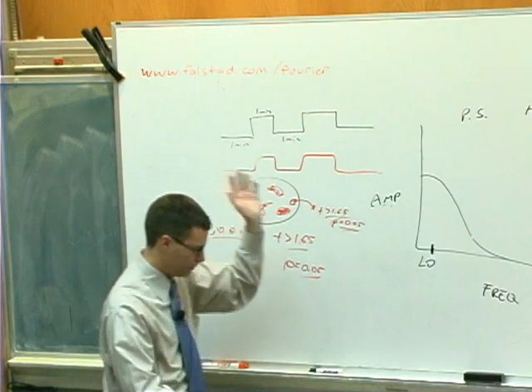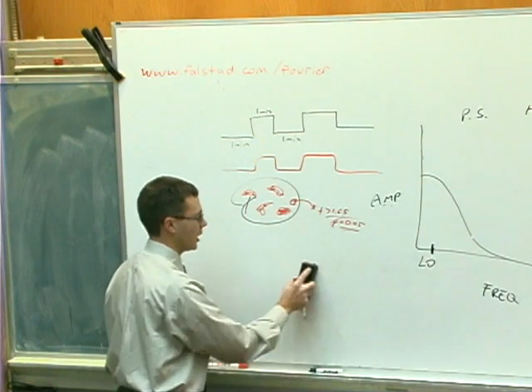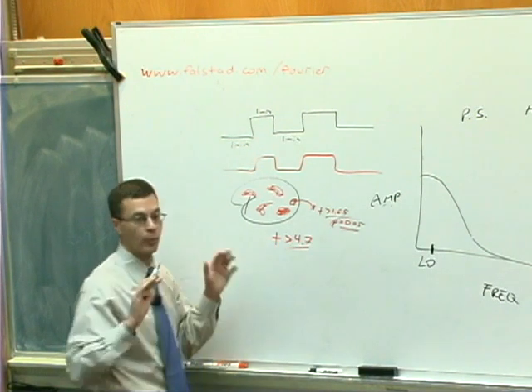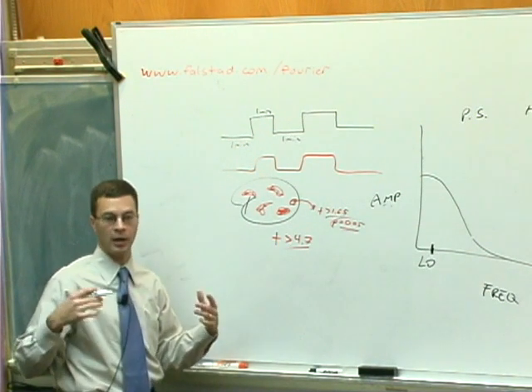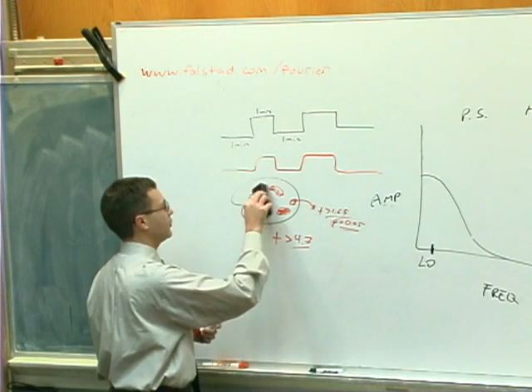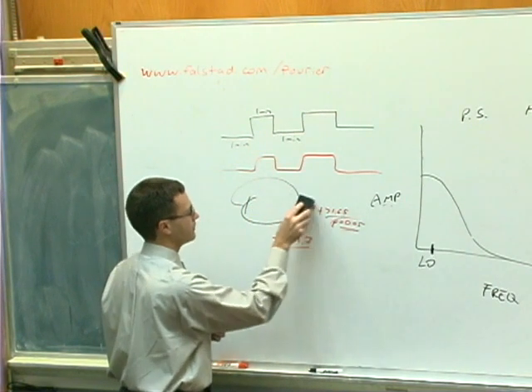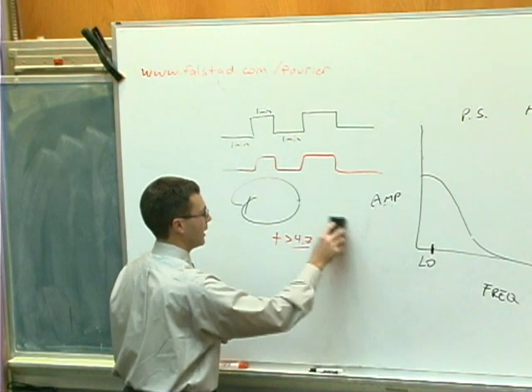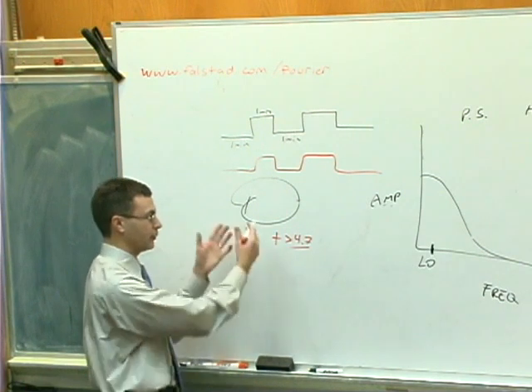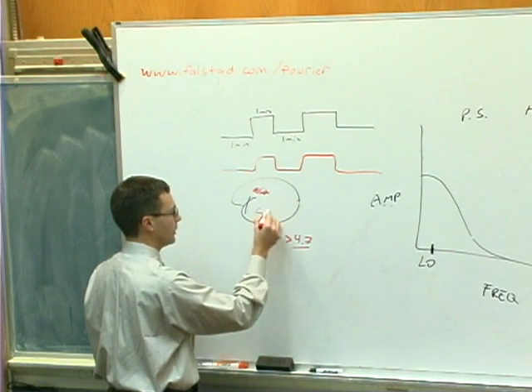So, whatever, I'm a sophisticated analyzer of BOLD fMRI data. I do some sort of correction, which we're going to talk about a little bit more on day 3. And so I now say the t has to be greater than 4.7. Take my word for it, this corrects for the number of voxels that I'm comparing. So now what I'm suggesting is that the chance of there being even just one false positive voxel in this map greater than 4.7 is now 0.05. So only 1 in 20 times should this map have even a single voxel in it by chance. But nonetheless, there's a couple of big blobs here that survive the comparison.